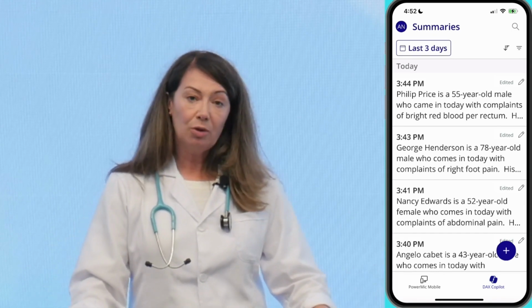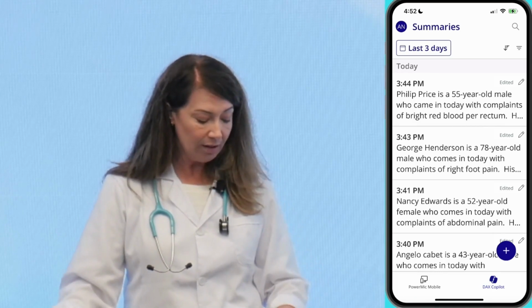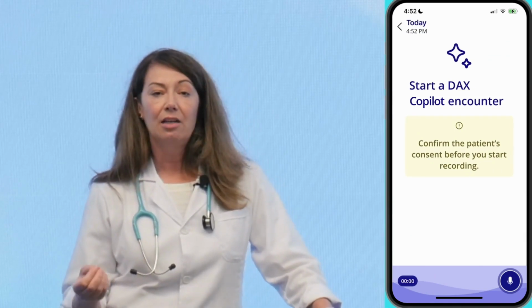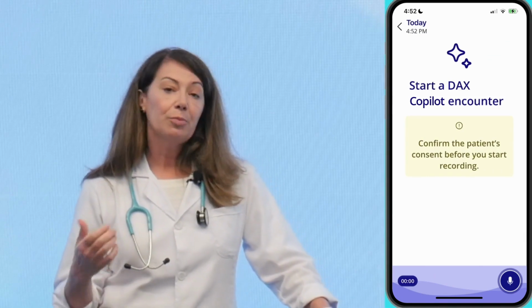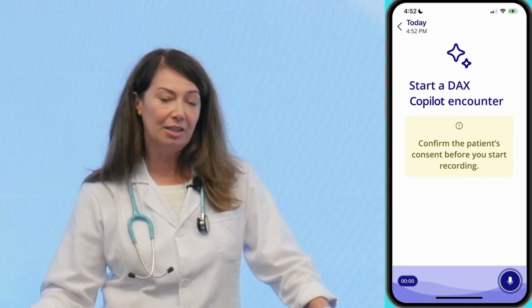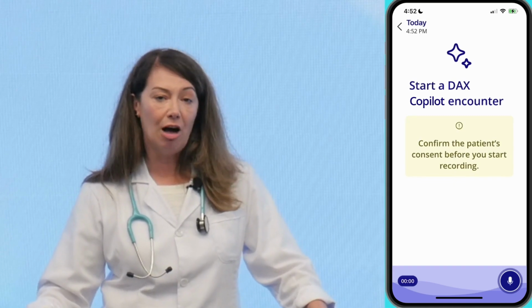Now, to begin the recording, I can go ahead and press the plus button down in the lower side of the mobile application. This takes me to the screen and just makes me aware as a clinician that I need to be sure that I've gotten appropriate consent from the patient in order to use this technology. Now, for the purposes of today's demonstration, my colleague, Caitlin, is going to be the patient. We're going to go through a mock clinical encounter, and she's going to be playing Maria Gonzalez, who's 35 years old, coming in for a cough.